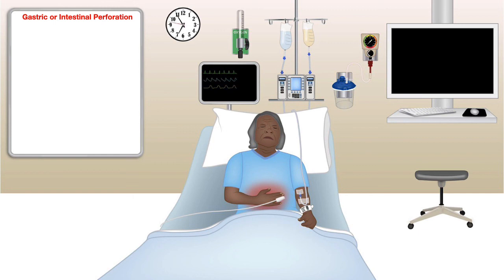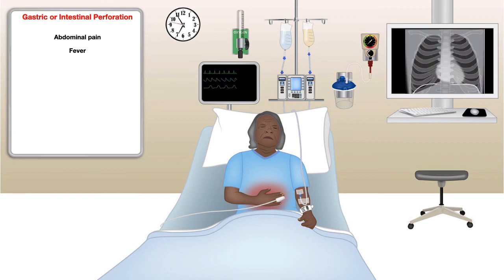But if it's not recognized during endoscopy, when the patient comes into the recovery or during their time at home after discharge, they may develop abdominal pain, they may have fever, and when you do an X-ray, you may see air under the diaphragm. If you suspect perforation and you don't see air under the diaphragm, you should consider doing a chest, abdomen, and pelvis CT scan with contrast.